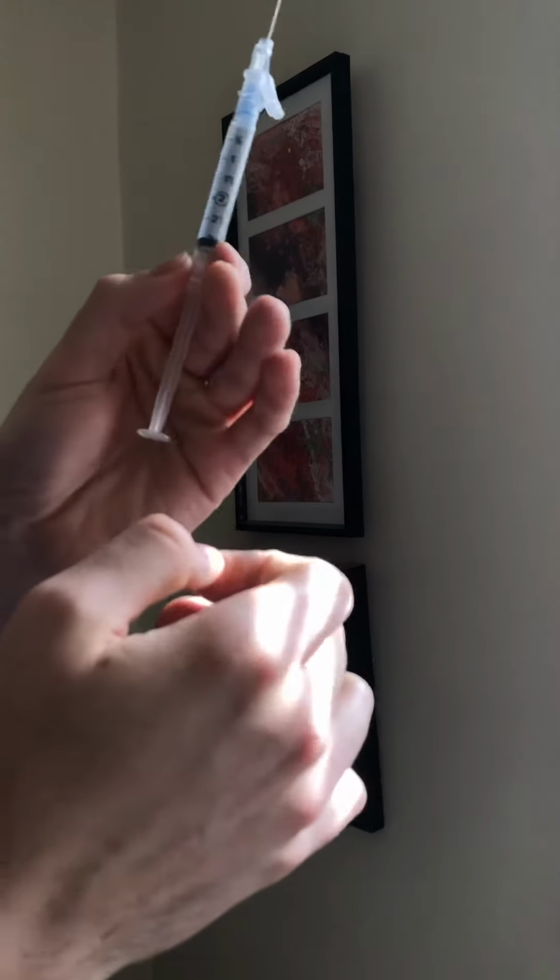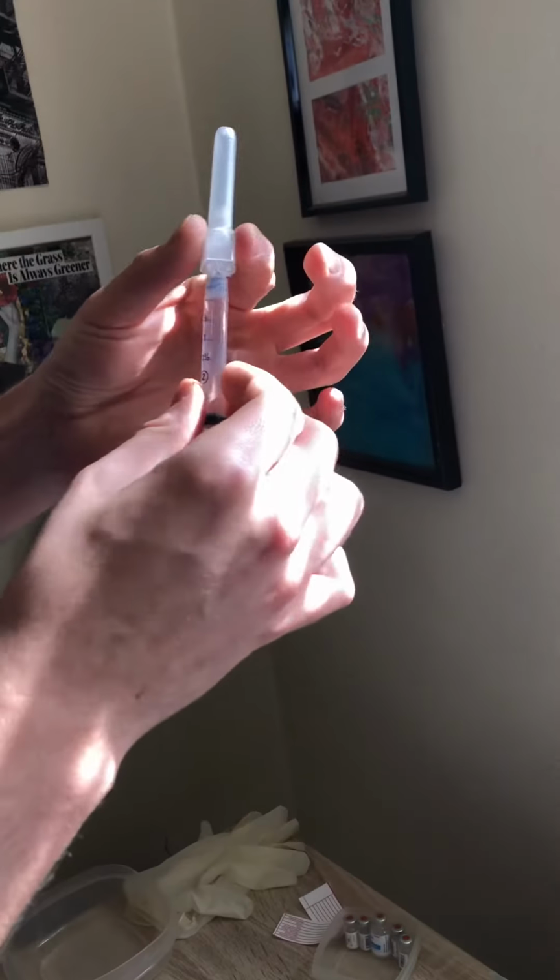There we go. Got no bubbles. Good to go. So now we're just going to safely scoop that up and cap it. I can just cap that like that. That's safe to do so. I'm not going to poke myself.